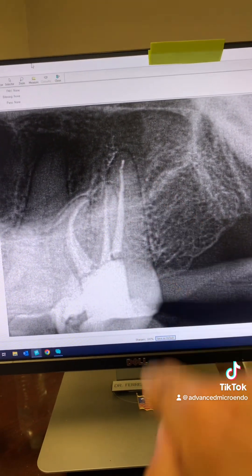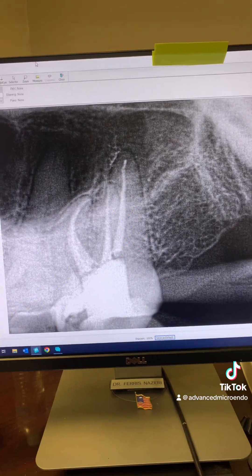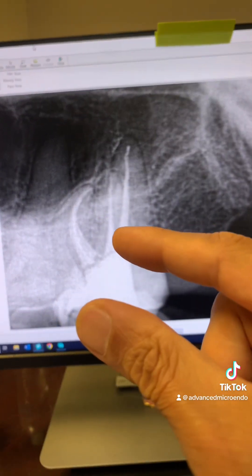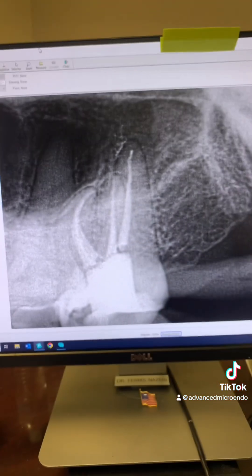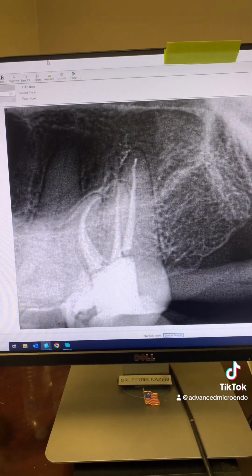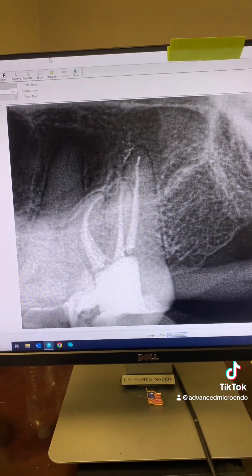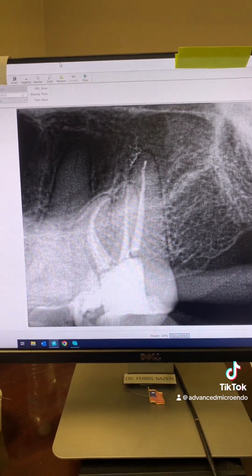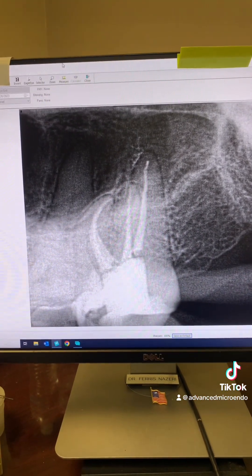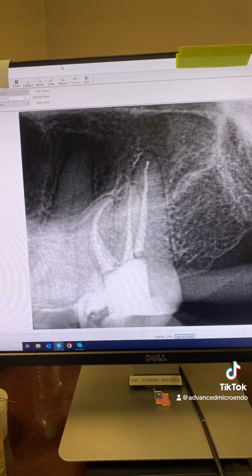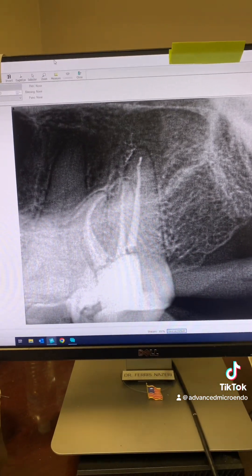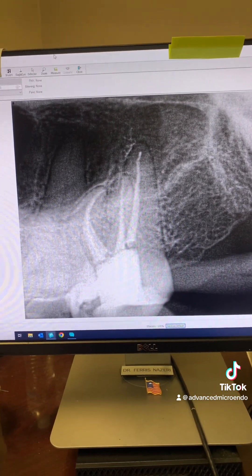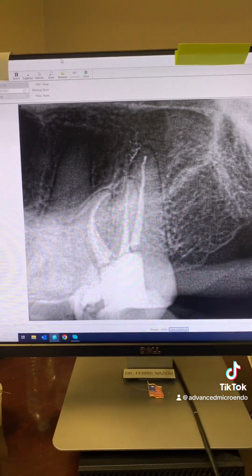Distal buccal and palatal — on a patient with TMD and opening this wide. As you can see, everything went great. We went ahead and temporized the tooth and referred the patient back to her dentist for the permanent restoration.